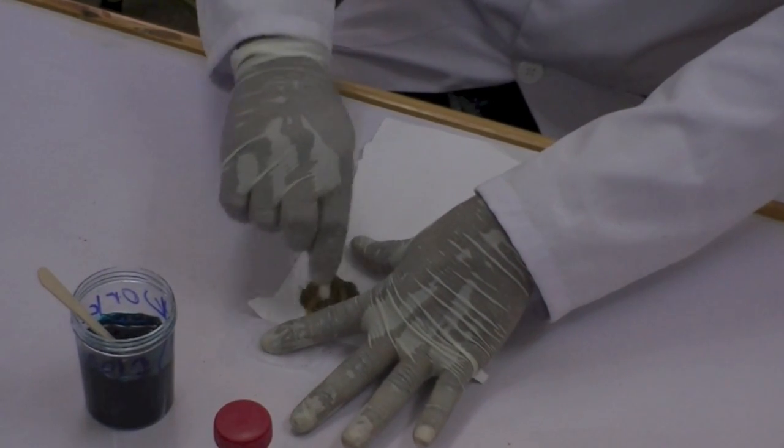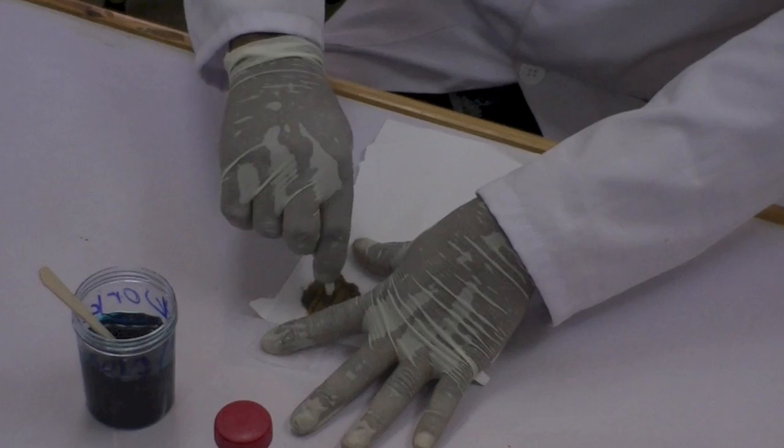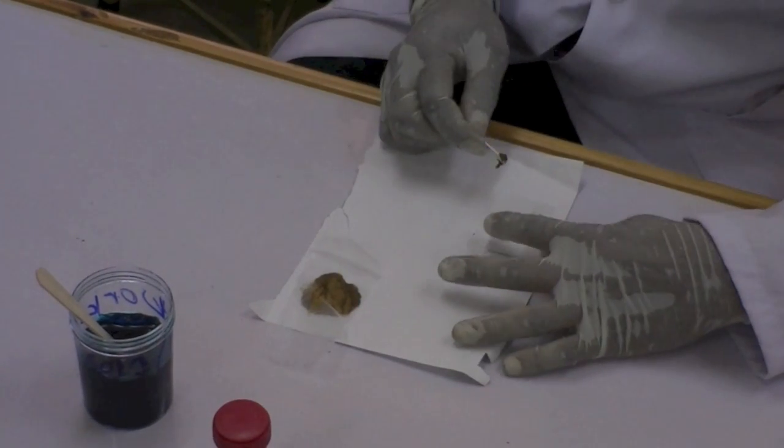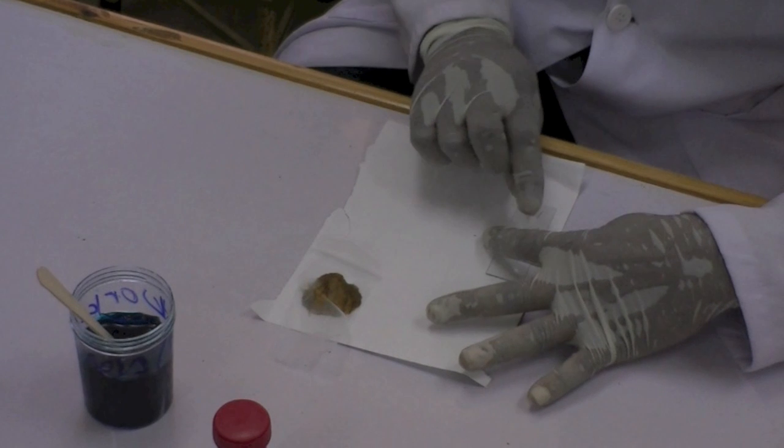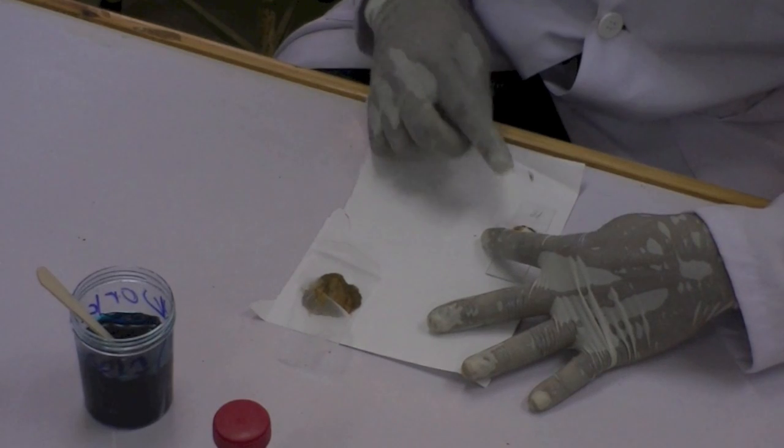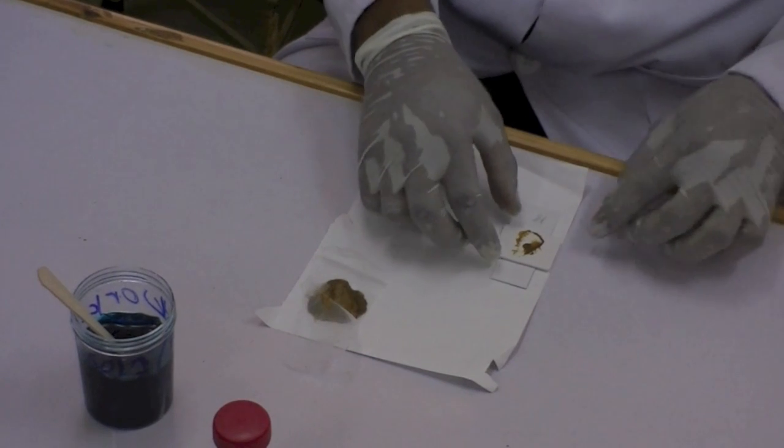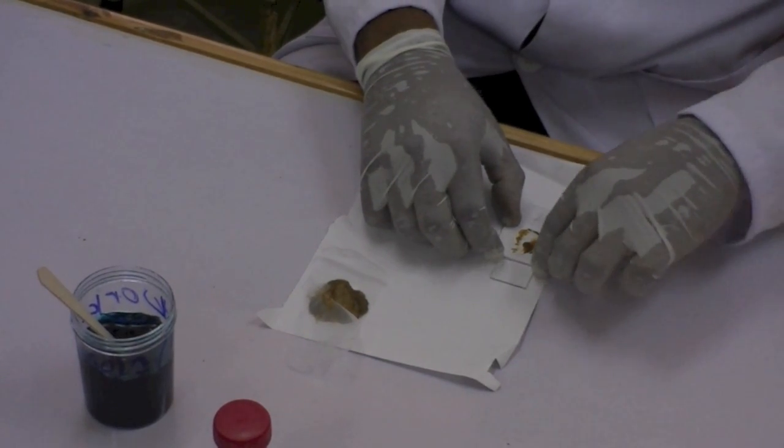To collect the stool that was sieved, scrape the spatula across the upper surface of the screen. Then put the stool from the spatula in the hole of the template so that it becomes completely filled. When removing the template carefully, you'll notice that a cylinder of stool is left on the slide.